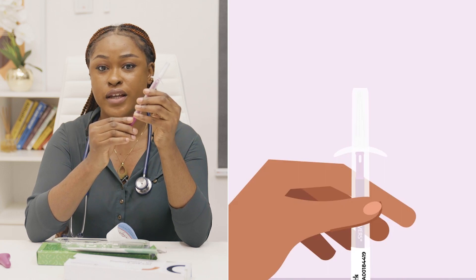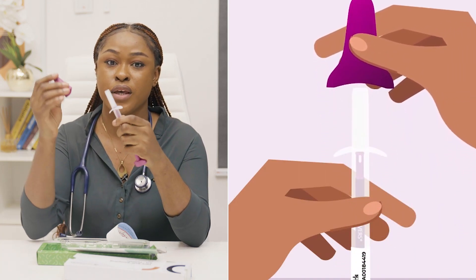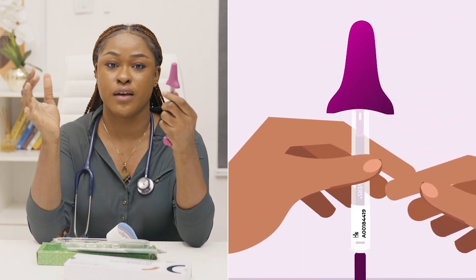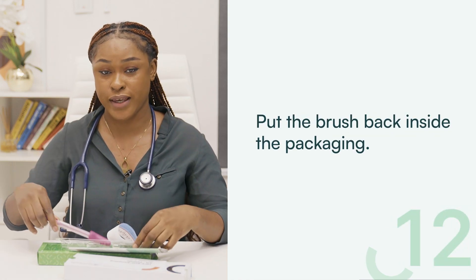Step 11: Hold the transparent end to ensure that the white brush does not extend again, then place the pink plunger cap back on top using your thumb and index finger. You will hear a click to know it's properly in place. Pull the brush back inside the packaging.